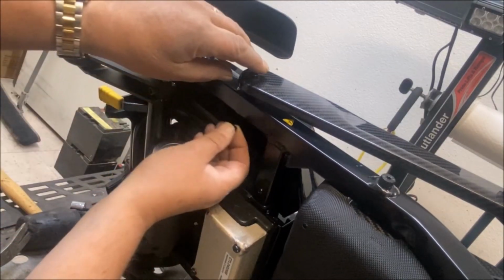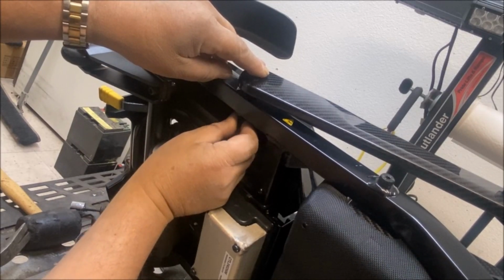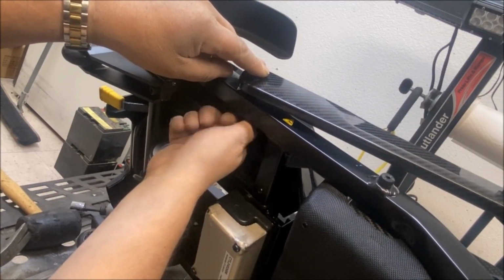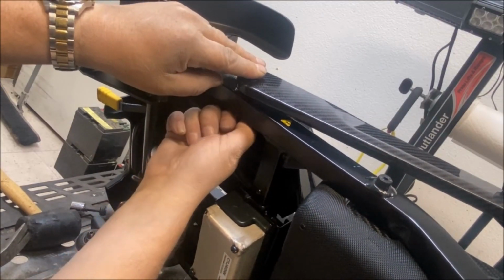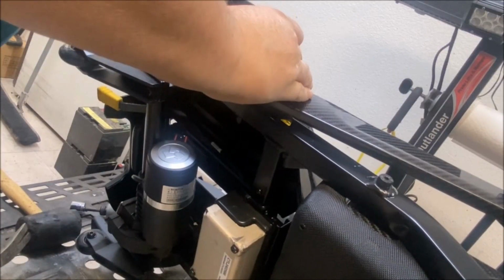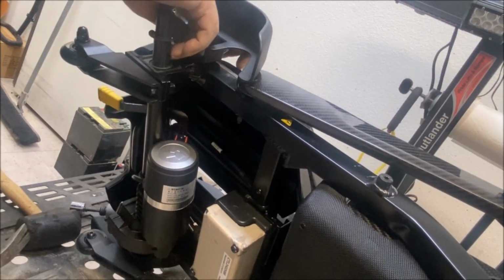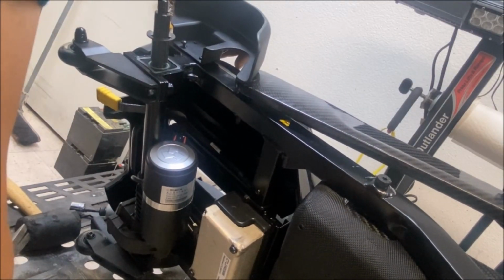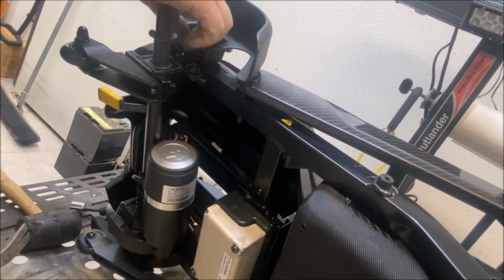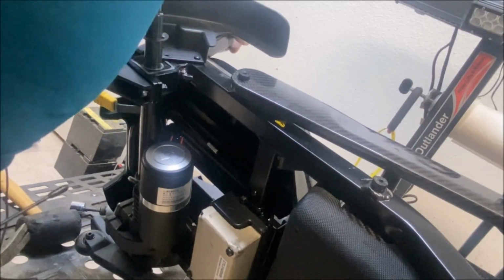And now you can put your insert back in, the washer and the acorn nut. Again, I'm not going to tighten them up until I get the other side done, but they're not going to go anywhere. I actually put these back in. I don't need to do anything else now. Oh yes I do. I need to tighten that up. Get ahead of the game.